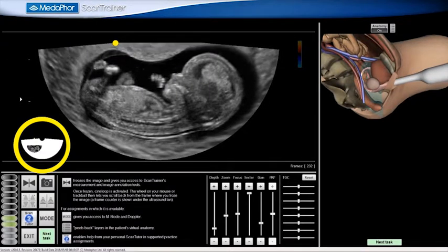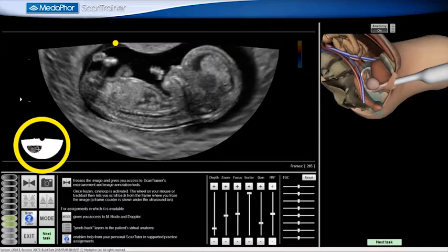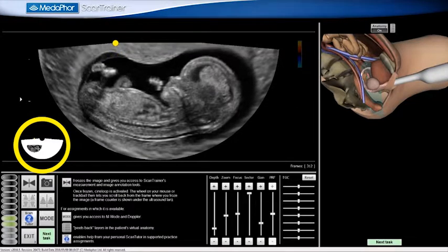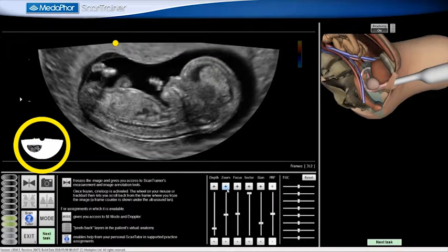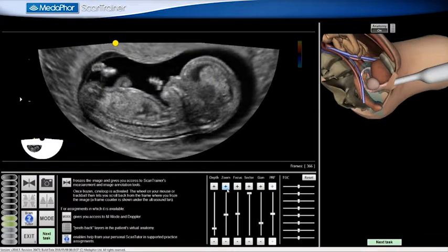To pan, I click on the smaller ultrasound image and move the image to my desired location. I then click on the smaller ultrasound image to stop panning.